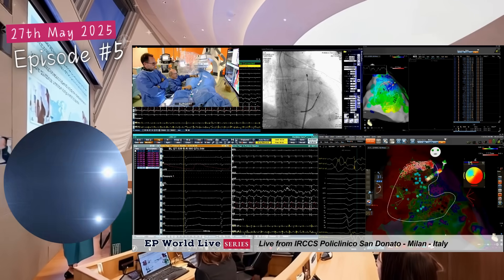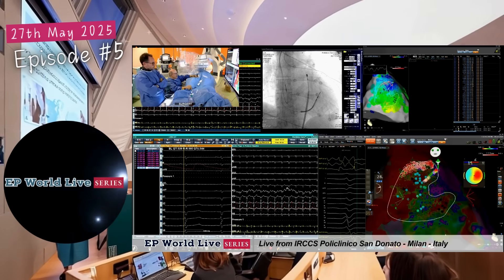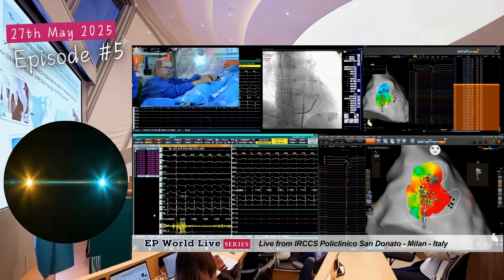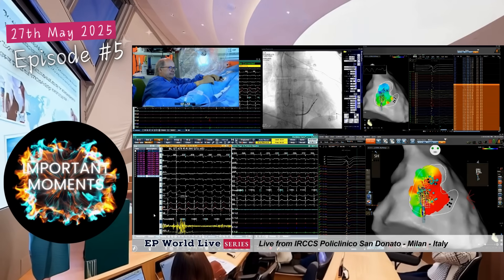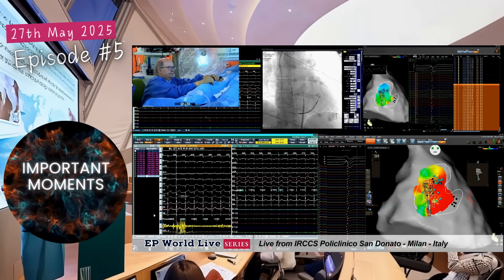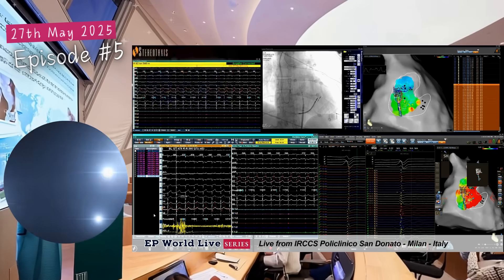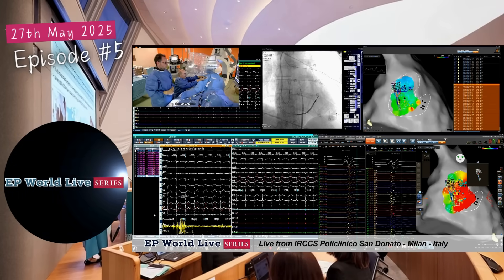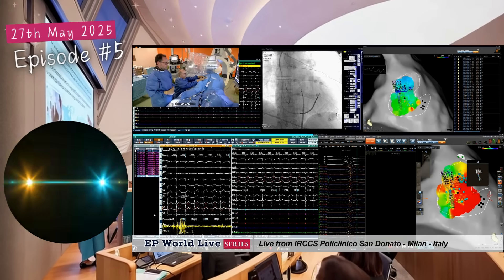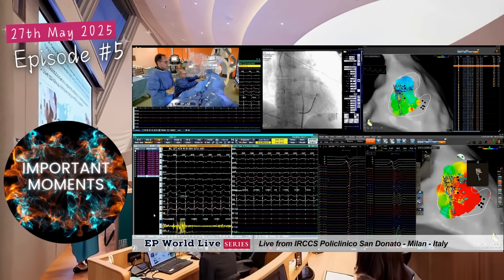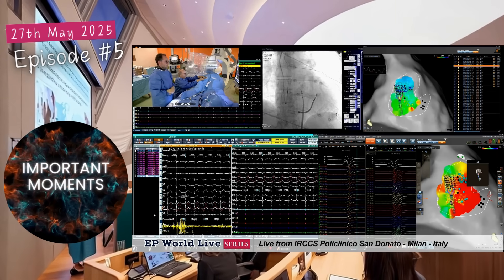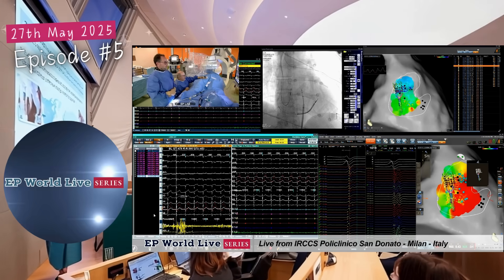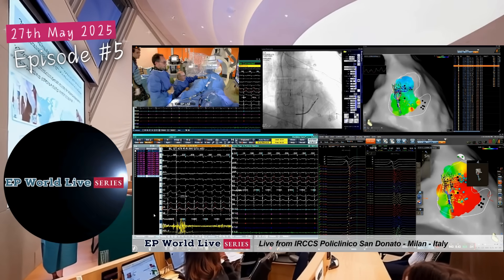When we ablate in this region at the border between right and left ventricle — can you show the signals before ablation? Okay, let's see here. Here you see the nice comparison: before and after.